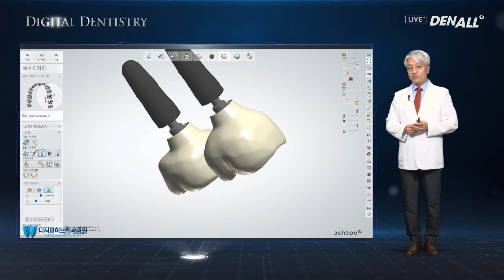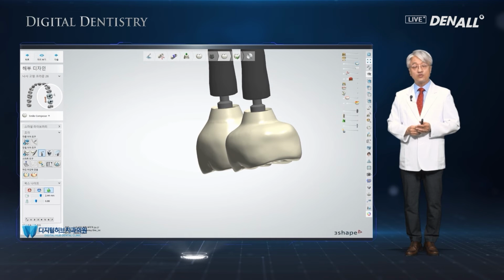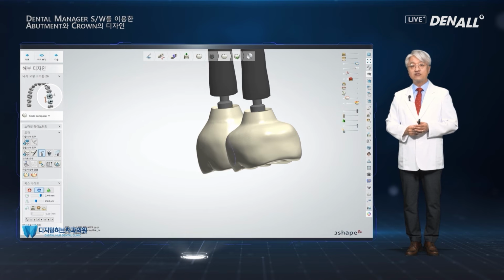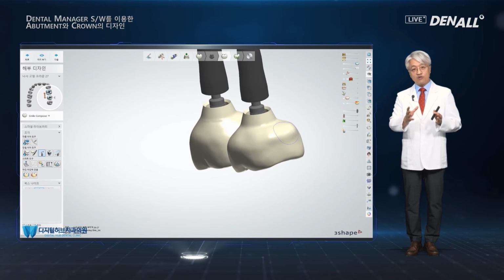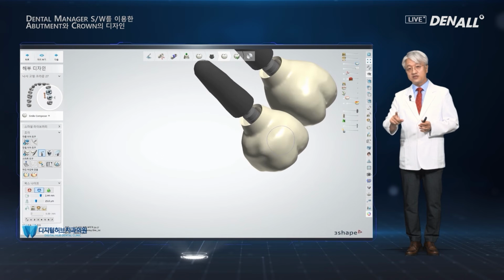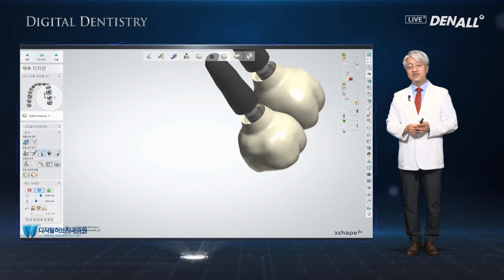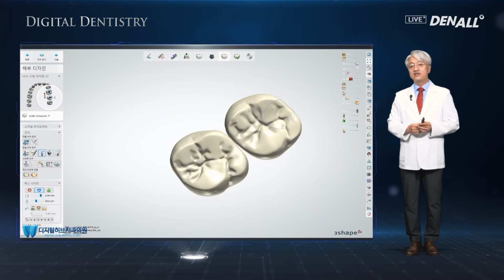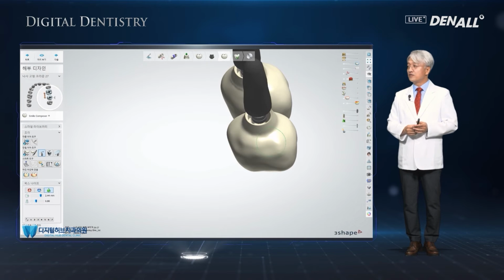If you use the software for the first time, there are some difficulties for anyone who tries it for the first time, but if you try several times and achieve good outcomes for patients, you will realize it's rewarding to spend time to get skilled in using the software. So that's what I have often felt.